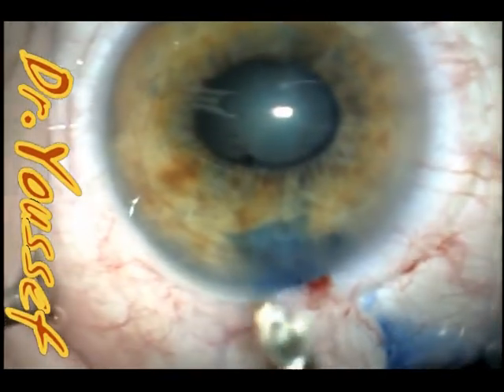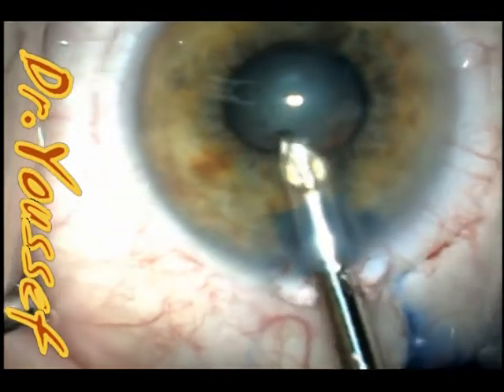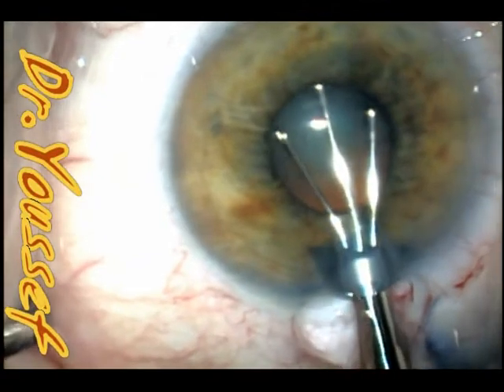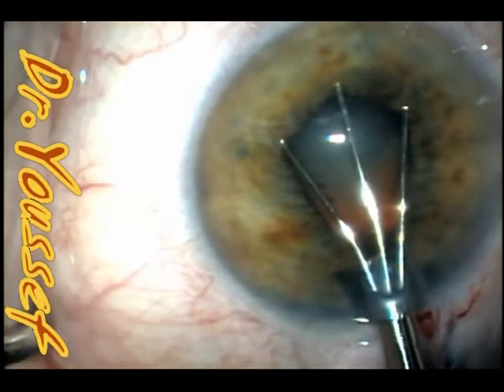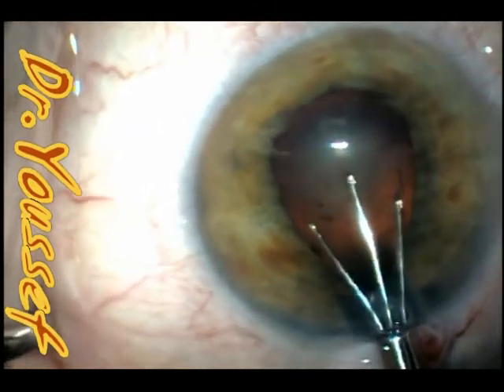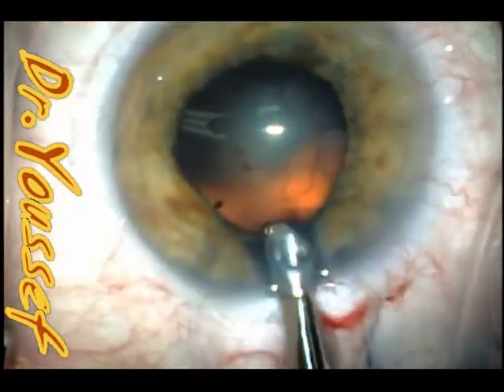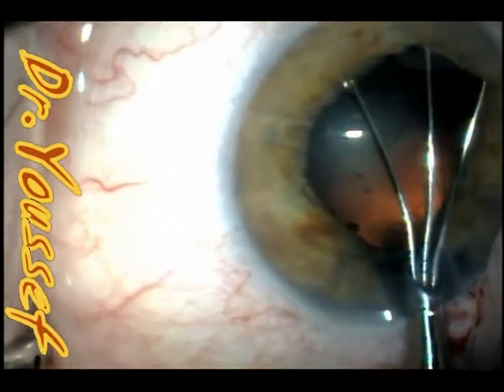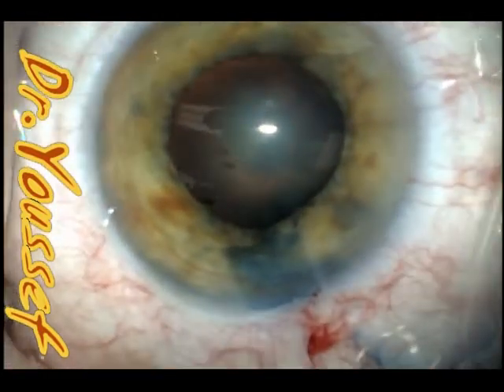That's the Beeler iris retractor. We introduce it and hook the proximal part, then push to stretch the pupil equally to allow the surgery to proceed safely. This way the pupil is enlarged. I usually do that three times — one in the middle and one on each side — to equally stretch the pupil without producing much damage to the sphincter. It's very gentle.